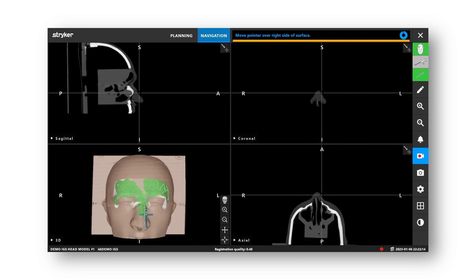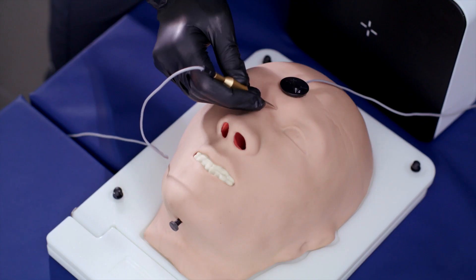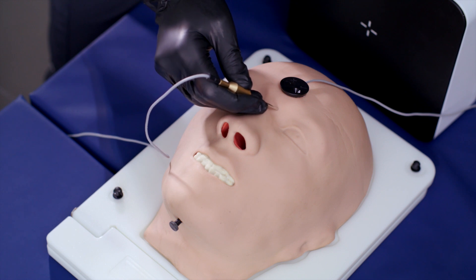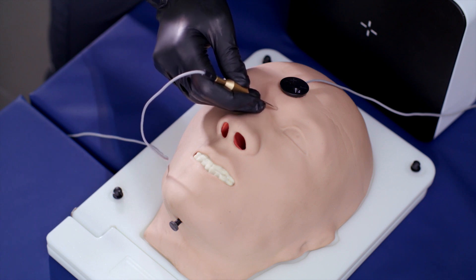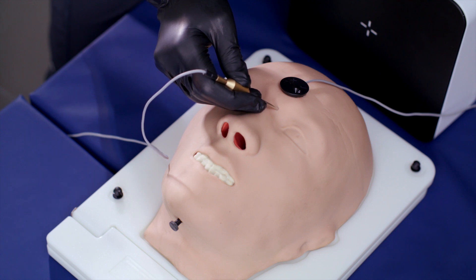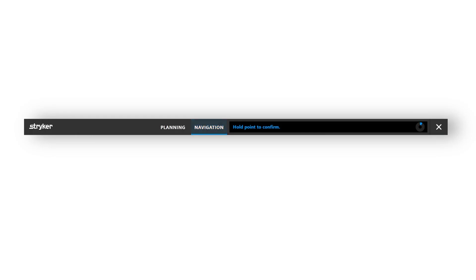After gathering sufficient data points, you will hear a third audible beep. Hold the pointer on an anatomical landmark that is immovable relative to the anatomy of interest to confirm the registration. A progress display will appear in the message bar and a fourth audible confirmation tone signals the completion of the patient registration.